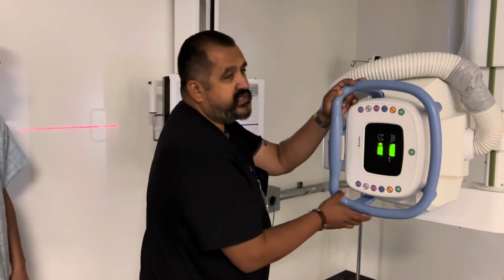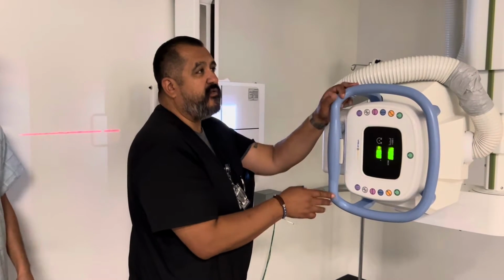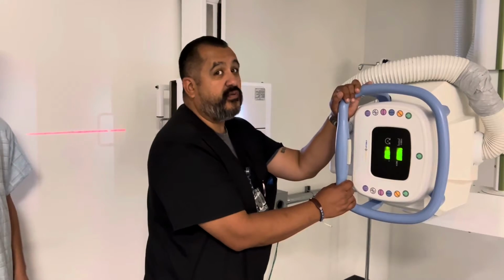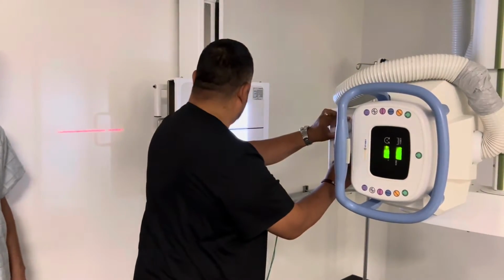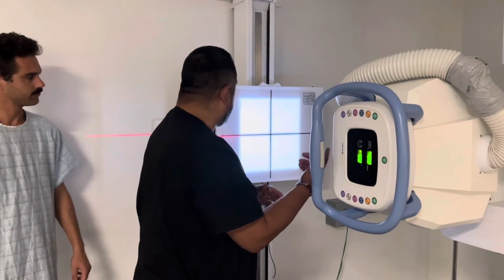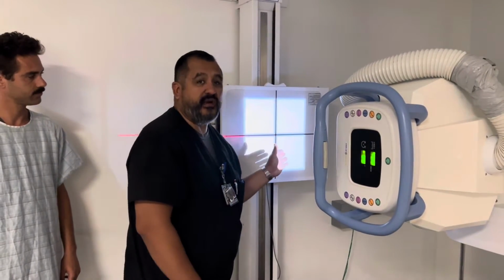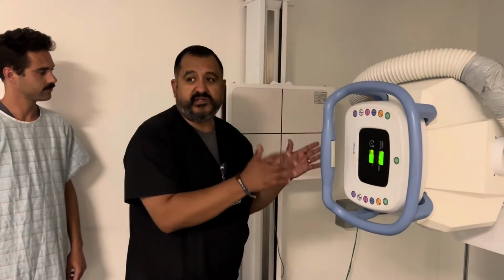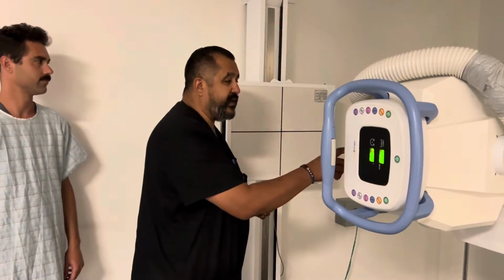If you're working with centimeters, 14 inches will be 35 centimeters and 17 inches will be 43, so it'll be 35 by 43. Let's get that set here. We're at 35 and 43, a 14 by 17 field right now. It doesn't look that big, but remember the beam diverges, so it's going to get what we need in here.